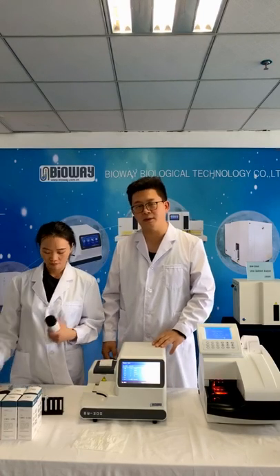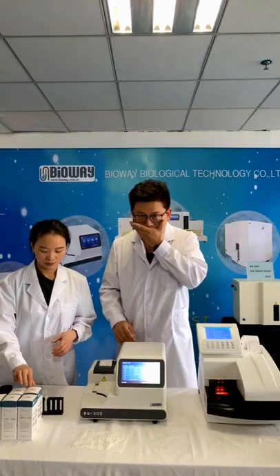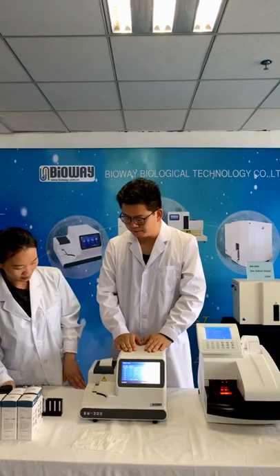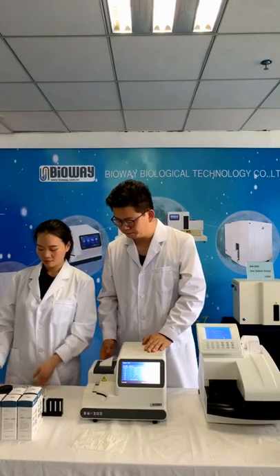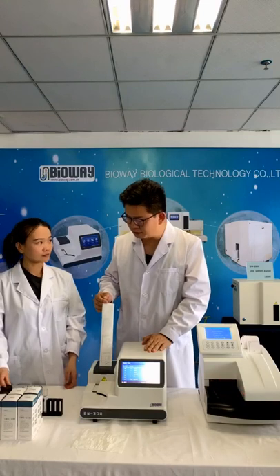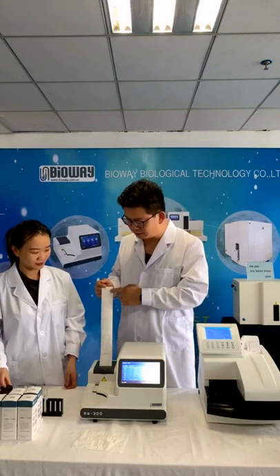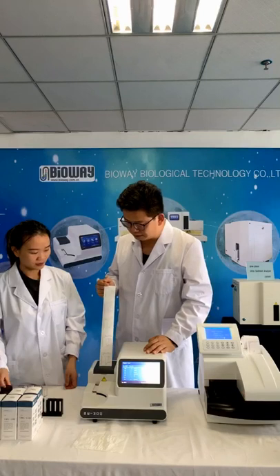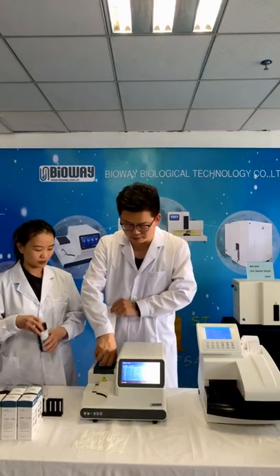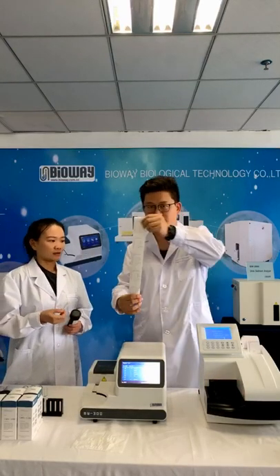If you have more urine strips, just place them as I've done, as fast as you can. That is okay at high speed. Do you remember how many strips we just put in? Five or six? It already has five results. The printing has ceased. That means this batch of tests has been done.